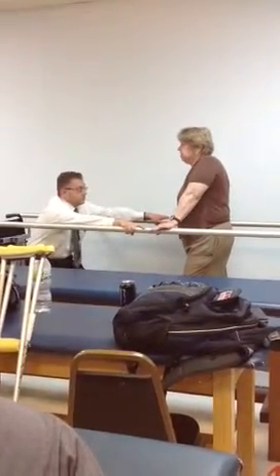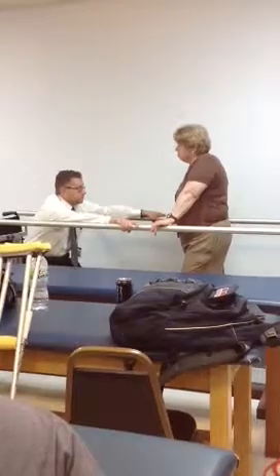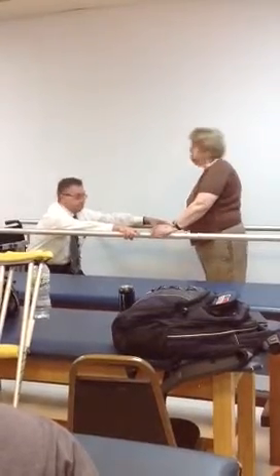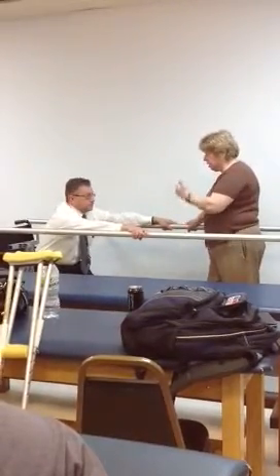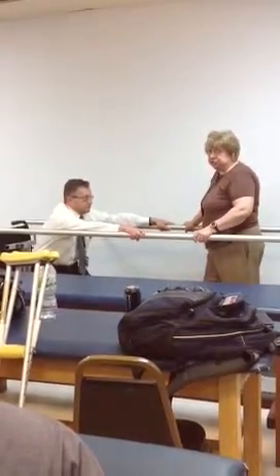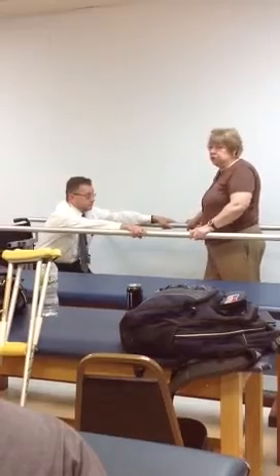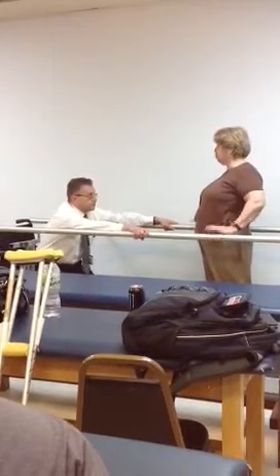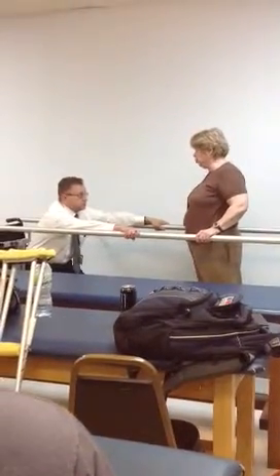And then, Justine, what am I gonna ask him to do? He's gonna bring his head up and back and bring his hips forward to lock them in. Okay, but what's gonna get him up? Oh, sorry. So bring his head up and back while he's sitting, he's gonna have to sit back in the chair. So now what he has to do is tuck his chin actually down, pull himself up to standing, and as soon as his weight is on his feet, then he has to tilt his head back a little bit. And remember, at this point, I've already told him that you have to stand with your hips forward, with your back way arched, in order to stay stable, okay?